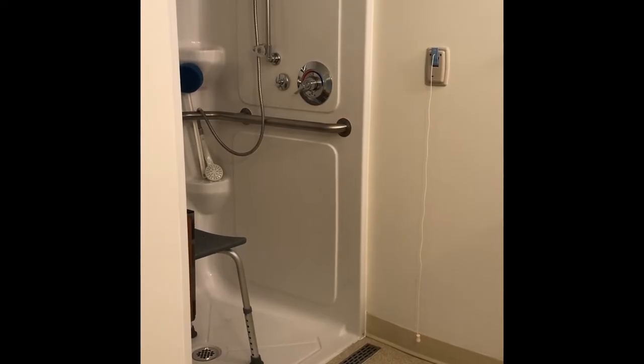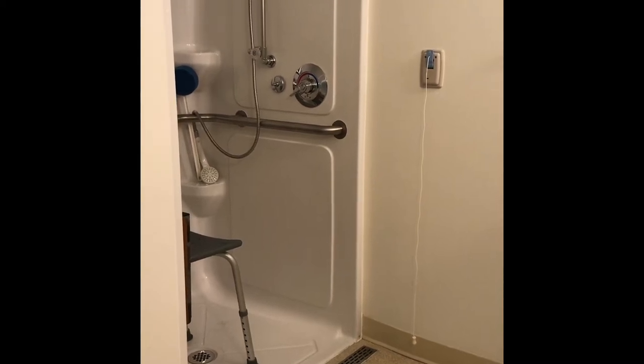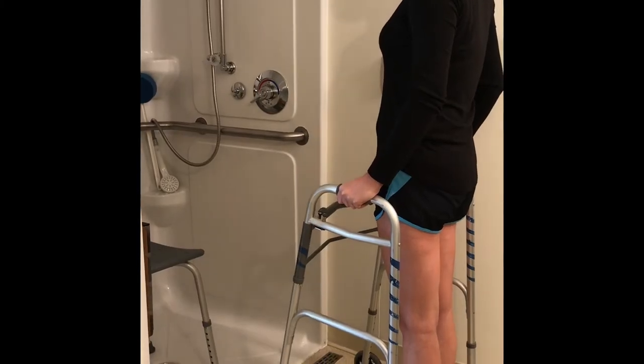For this demonstration, the patient had her right hip replaced. Walk up to the shower with your walker, then turn around with your back to the shower while using your walker.